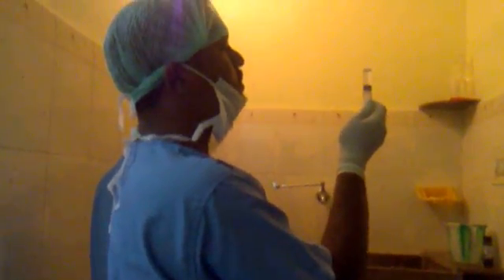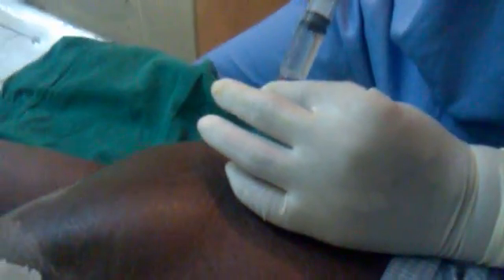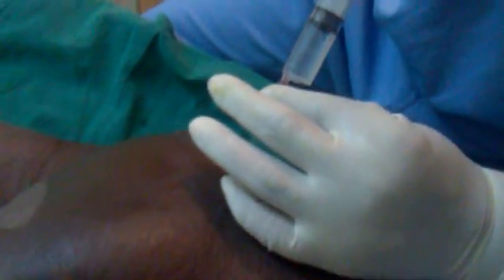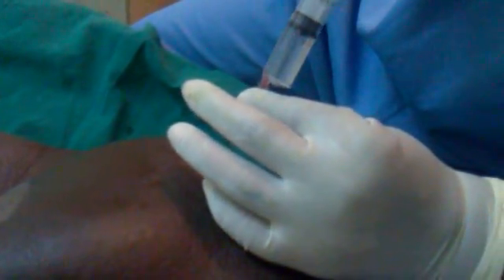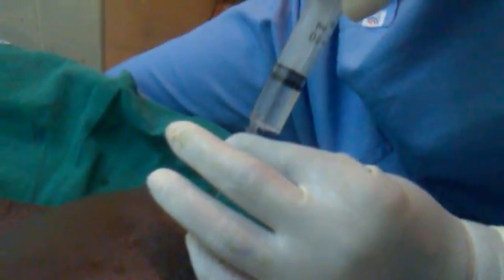This is a case of diabetes and hypertension, ischemic heart disease, with frequent ventricular premature contractions, which is resistant to medical therapy. So I am going in for a safe anesthesia technique, utilizing peripheral nerve blockade.